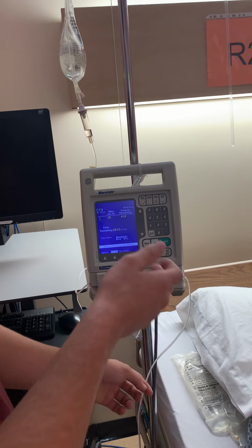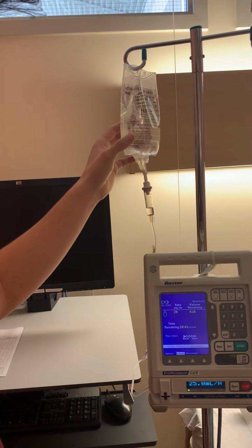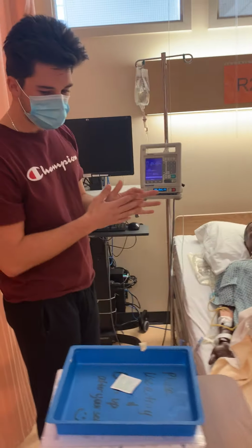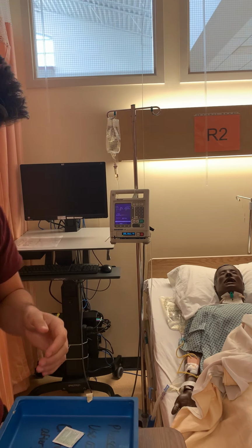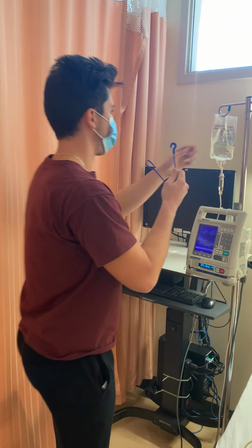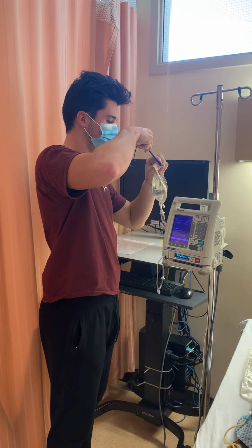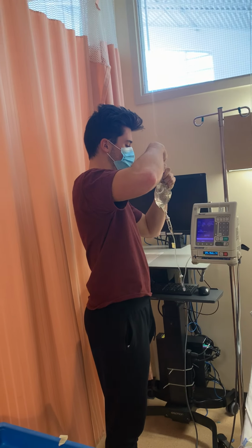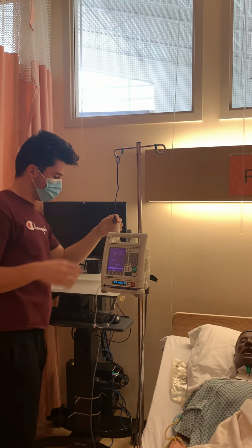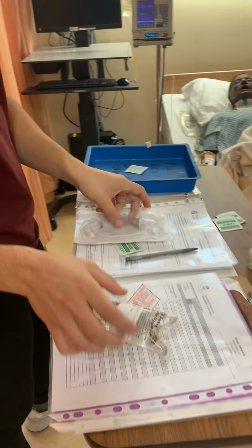I can check my pump that the primary rate is at 25 as per the doctor's orders, and I can see that I have my primary bag here of normal saline, which is compatible. Once I've ensured that all the ports are open and everything is infusing well, I can go ahead and set up my medication. I'm going to start off by grabbing this clip and lowering my primary bag. Once I have lowered my primary bag, I can go ahead and set up my secondary supplies.